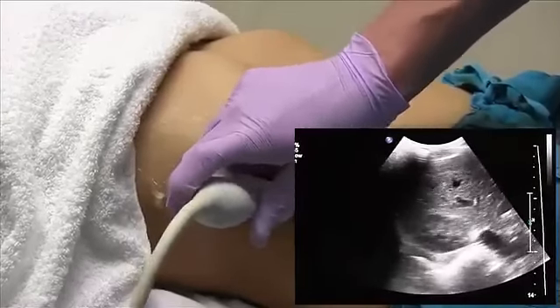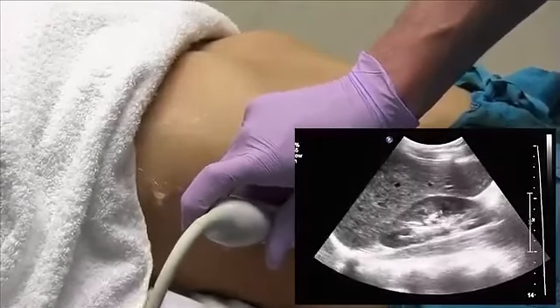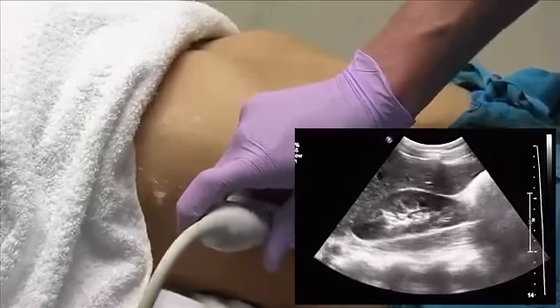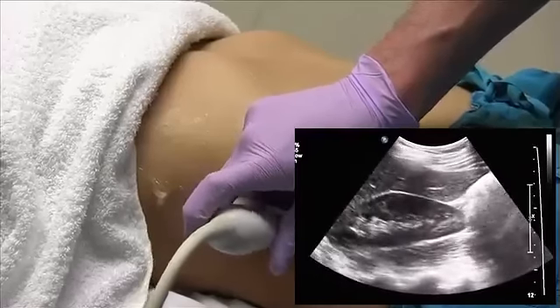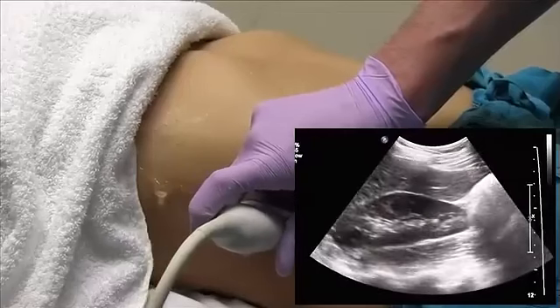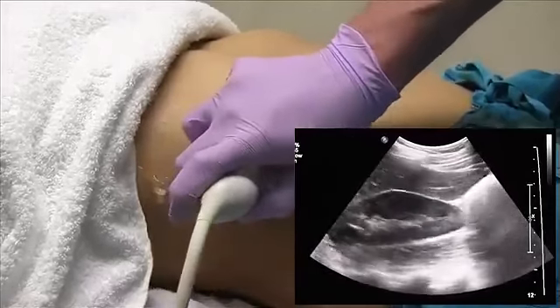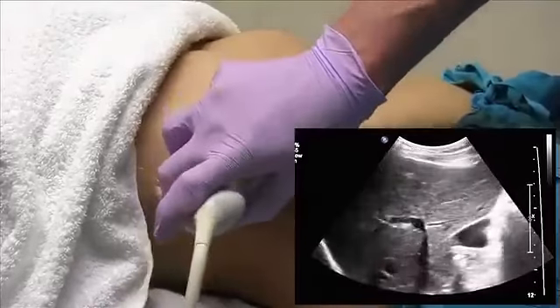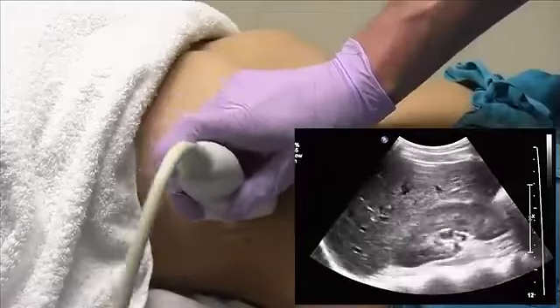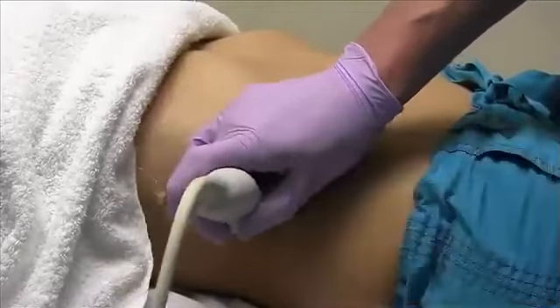And then, as you turn coronal, you'll be able to evaluate if there's any liver enlargement. The right kidney and the liver tip should both end at about the same spot. The whole time you're going to want to make sure that you're sweeping through the liver completely, just again to make sure you're not missing any pathology here.